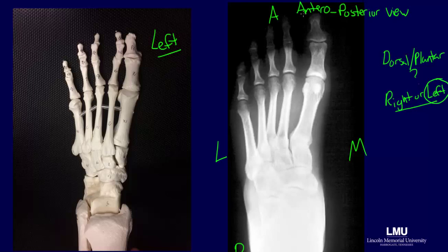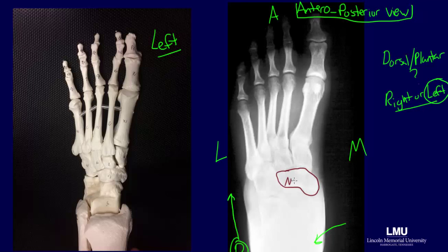Remember that our systematic approach is to evaluate from proximal to distal. We will start where we find enough contrast to differentiate the bones of the hindfoot from the midfoot. The first bone is the navicular, which plays a structural role in supporting the medial longitudinal arch of the foot. I'm outlining it here now in a maroon color. Now let's find it on the reference image — the navicular is right over here.